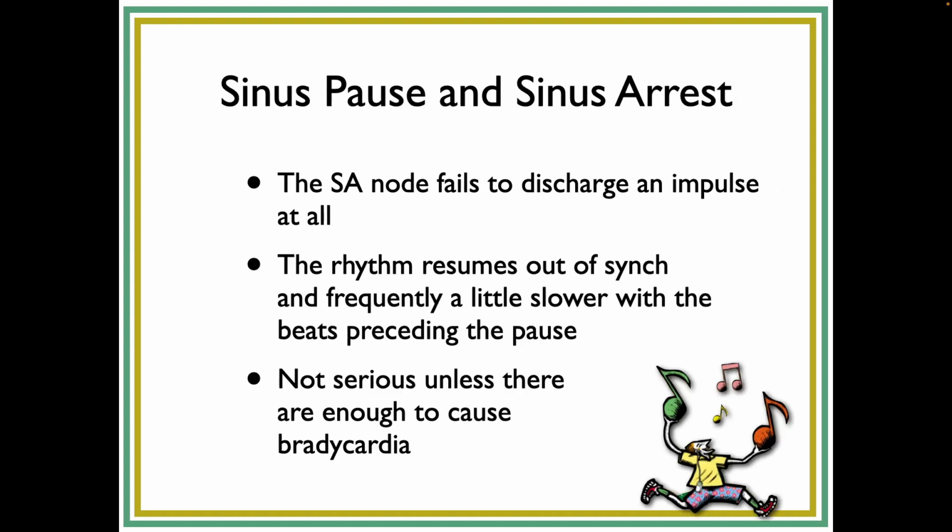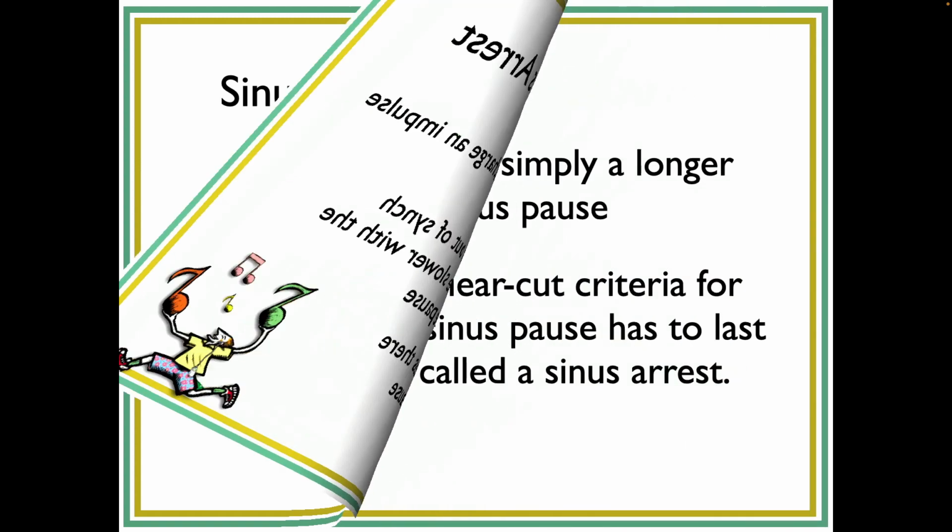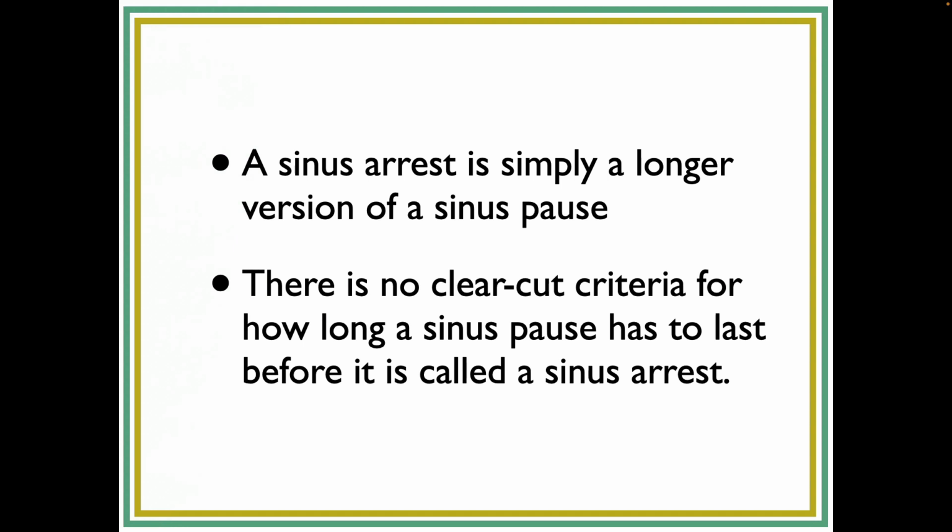Okay, sinus pause and sinus arrest. In this particular case, it's the pacemakers themselves that stop. So nothing about gates or any of that stuff. And really, the only real difference on the ECG strip is that the rhythm will resume out of sync. And a lot of times when it starts back up, it starts slowly. Okay. And a sinus arrest is simply longer.